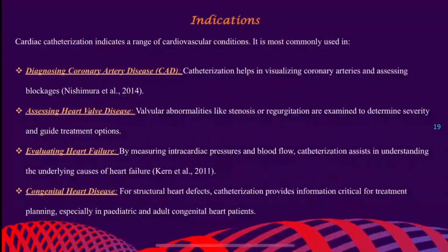Indications: cardiac catheterization indicates a range of cardiovascular conditions. It is mostly used in diagnosing coronary artery disease. Catheterization helps in visualizing coronary arteries and assessing blockages. Assessing heart valve disease. Valvular abnormalities like stenosis or regurgitation are examined to determine severity and guide treatment options.